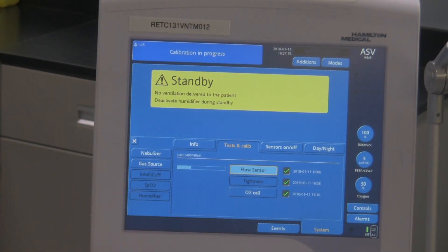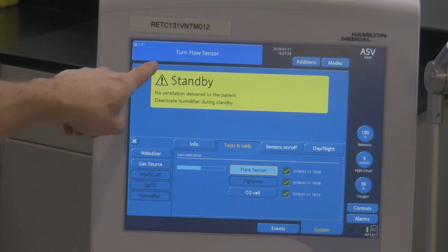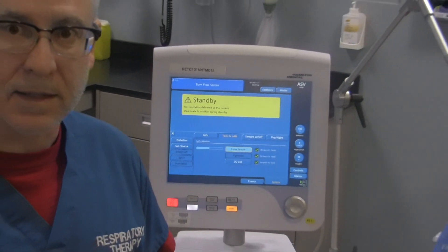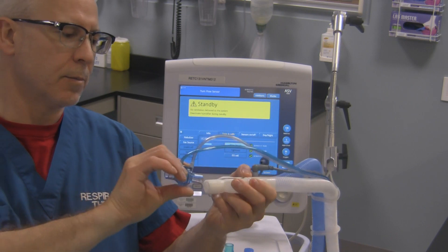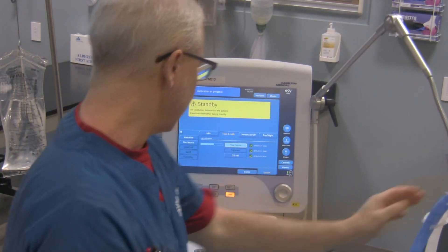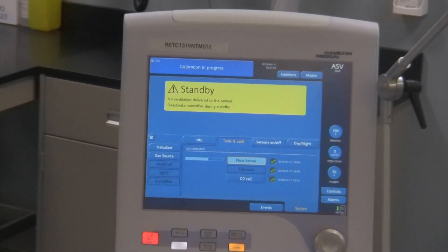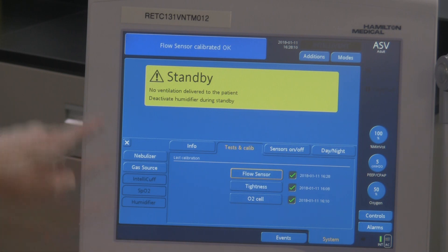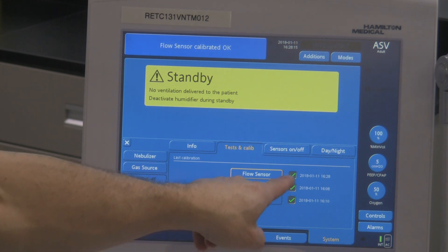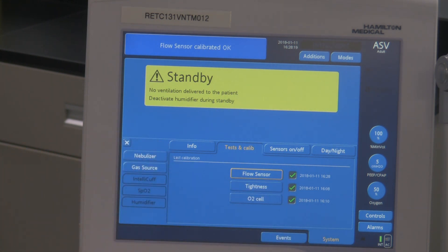Calibration is in process. The sensor test is still being done. It shows with this bar how far it's progressed into that particular test. Now it says again up here: turn flow sensor. So what we need to do is take that flow sensor again and simply turn it back to the original position. I'm going to gently take this off and turn it back to the way it was before. The ventilator automatically recognizes that and continues the flow sensor check. Flow sensor calibrated OK — it gives us that green check mark as well as the new date when the flow sensor test was last checked.